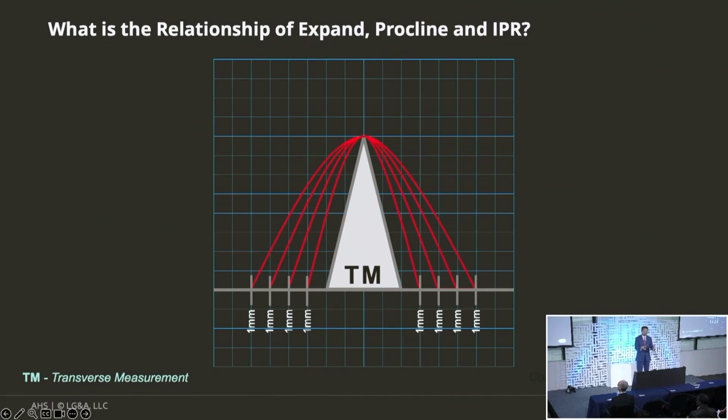So we're talking about the teeth at the beginning are our V-shaped arch. The original white triangle in the center is our V-shaped arch, which comes with all this crowded teeth. We've got all these crowded teeth to contend with. How are we going to resolve this? Oh, I feel like I need 0.5 millimeter of IPR in 8 places. You don't. I feel like I have to take a tooth out. You don't. Okay, here we go.